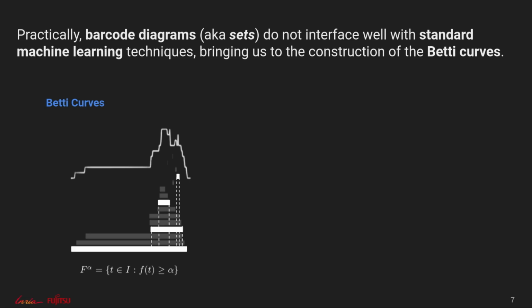What are Betti curves? So let's consider a persistence barcode, for which we vectorize the radius space. Each component of the barcode diagram is then referred to as a function taking 1 as value on the radius defining it, and 0 anywhere else. The sum of these functions defines the Betti curve. An example of that transformation is here on the slide. Now, remember, we decided to go with that example for upper level filtration, but we could have gone for the sub-level filtration as well. Applying the same methodology, we end up creating another Betti curve representing the other filtration.